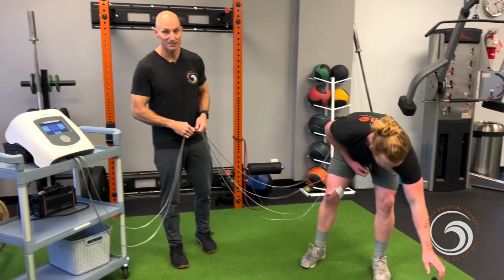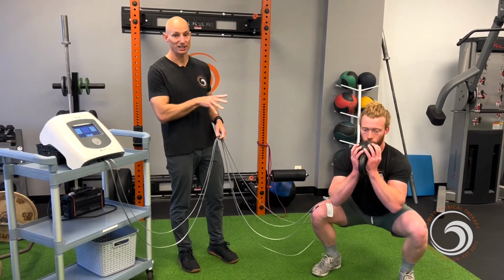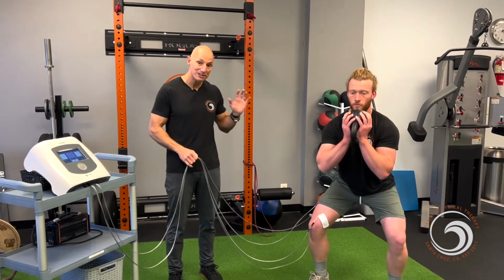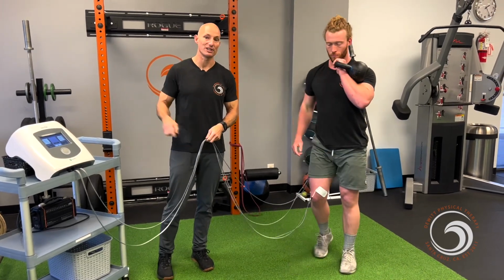Later in our rehab phases, we can also load this. So we can add a goblet squat. And so now he's working harder, we're loading him, but even though his movement patterns are really competent, we're still going to try to get as much out of his quads, glutes, that whole lower quarter as possible, and we're doing so because we're using that Neubie.